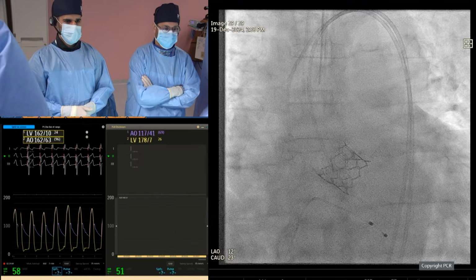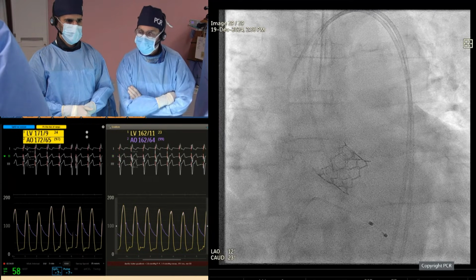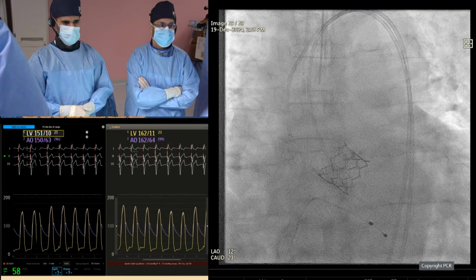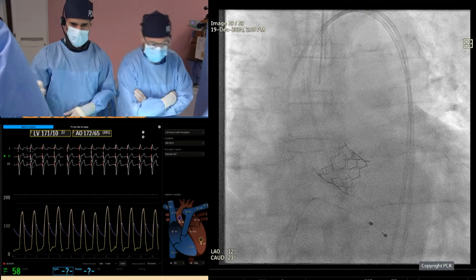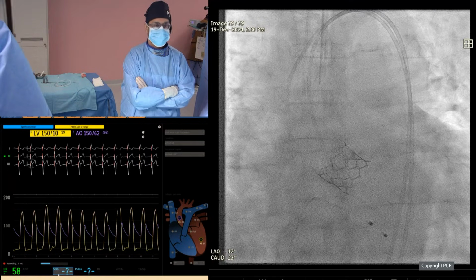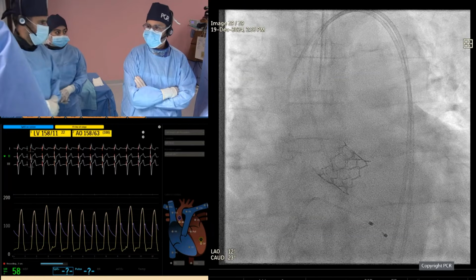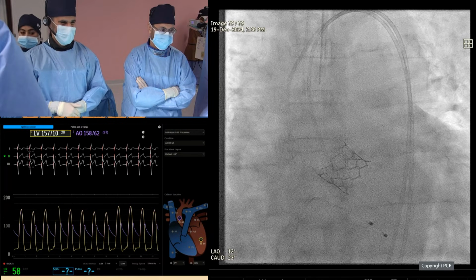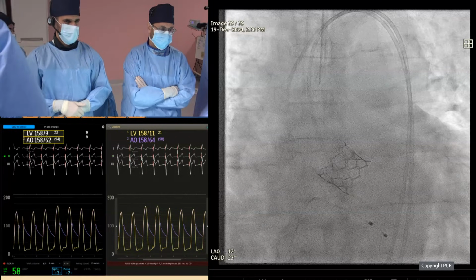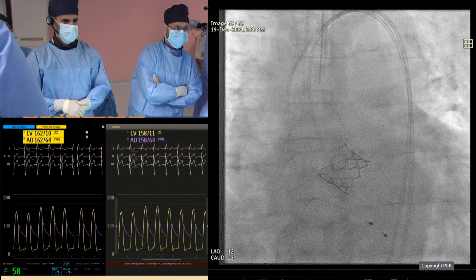Christian, do you pace over the wire? Oh, please, go ahead. The cusp overlap, we use it for self-expandable, but for balloon expandable, the coplanar, we use it for the balloon expandable, but cusp overlap, we use it for the self-expandable. Christian, do you find pacing over the wire, the LV wire, which is, I guess, your usual practice, better with a small Safari versus extra small? And does that loop of a Safari matter for the contact on the LV, and is it more predictable?